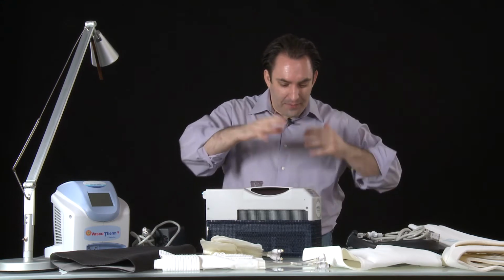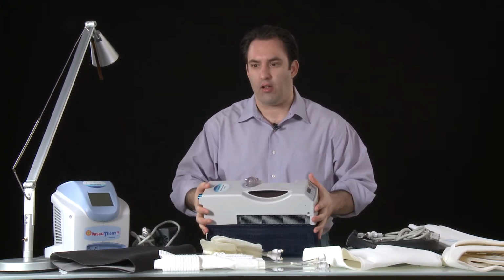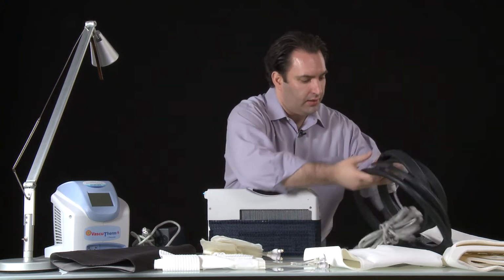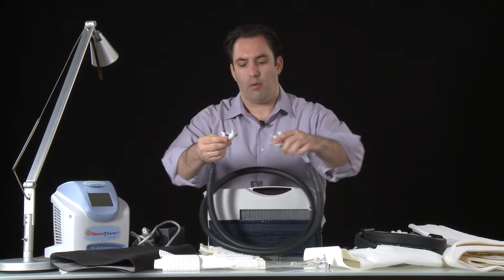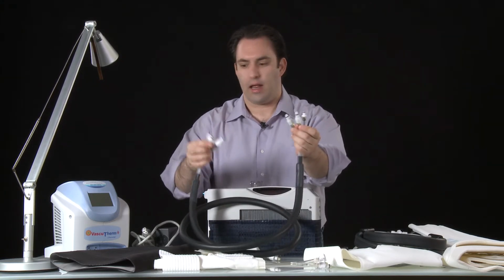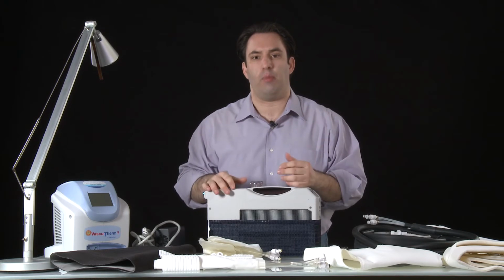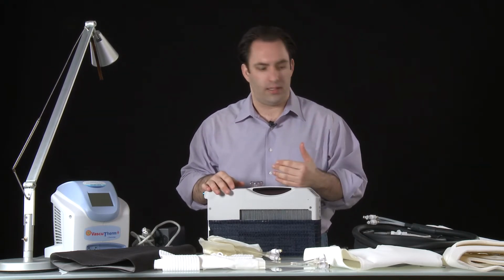All right. Control panel, okay, filter around the outside, the tank opens up, and we fill it with distilled water. And it's got a hose here, which is connected to itself right now, but we've got an outgoing and incoming water line, that's these guys, and then a compression line, okay? That is for joint compression and temperature management, for pain management and local inflammation management of the joint itself.